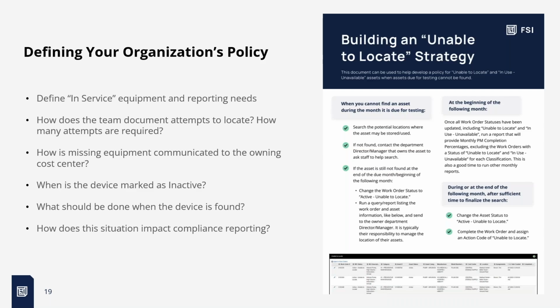When do you mark the device as inactive? Again, when do you take that out of your inventory? And then what happens when you do find it? When you do find it, what's your strategy, what's your policy around making sure you're putting it back in service with the proper documentation? And then how does all of this impact your compliance reporting? How are you reporting on all this to whatever standards you're adhering to? And again, we'll get into the details of some of those when we get to the inventory part, which we're going to talk about next.